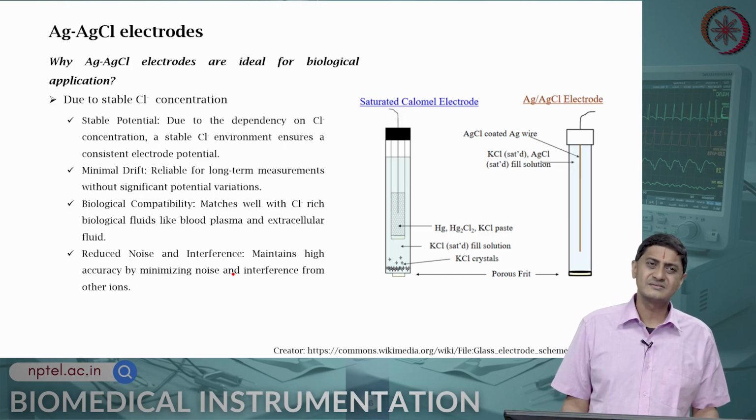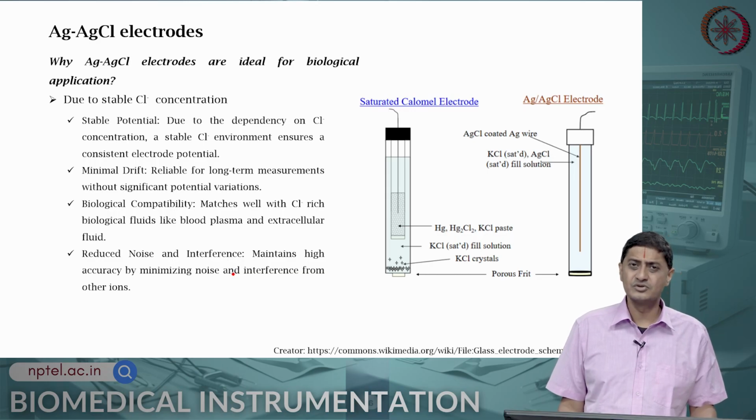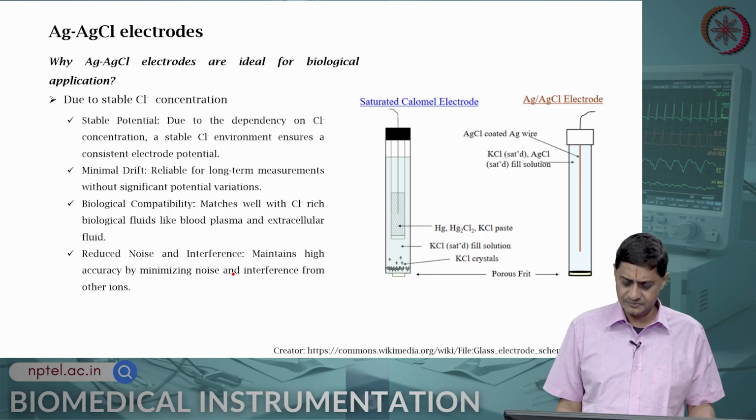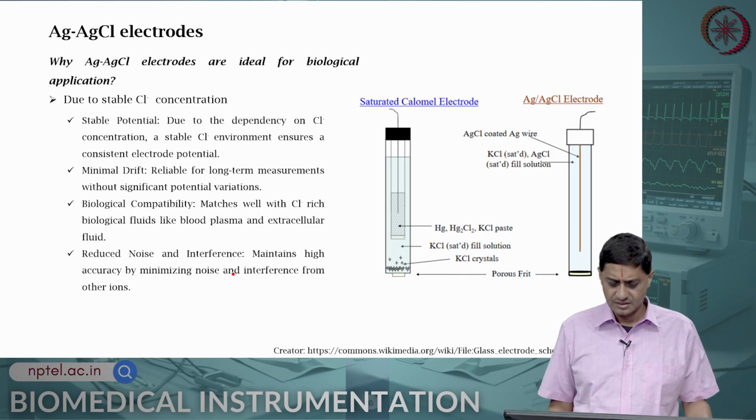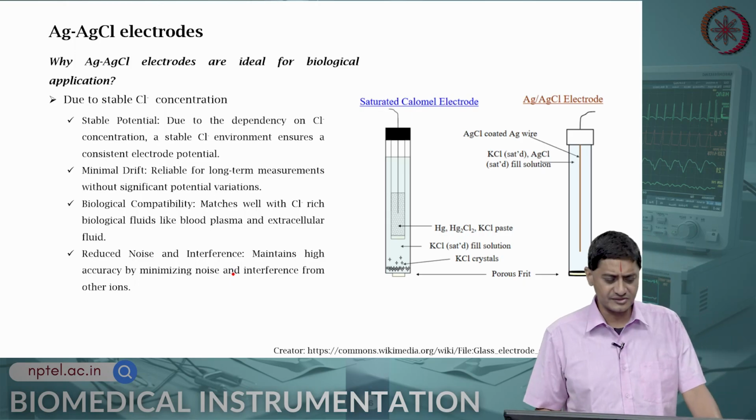Why is this the ideal solution for biological recording applications? Because there is stable chloride concentration.